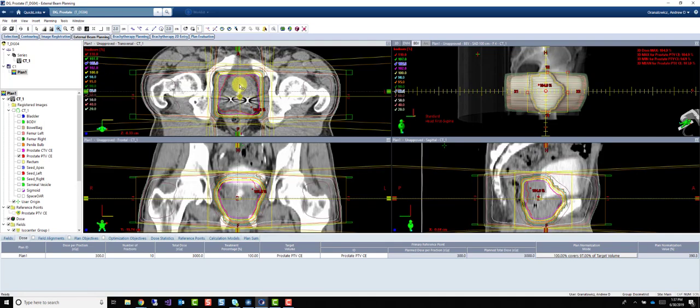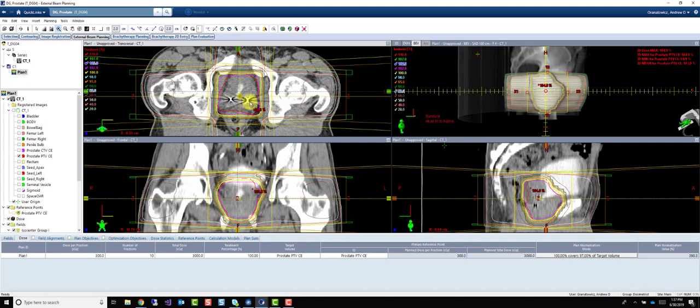You can see here that our plan is getting more and more conformal the more beams we add. If you compare this to our APPA video or the three-field videos, we get this nice conformal shape. It's very homogenous, very symmetrical, because we have a symmetrical beam distribution.